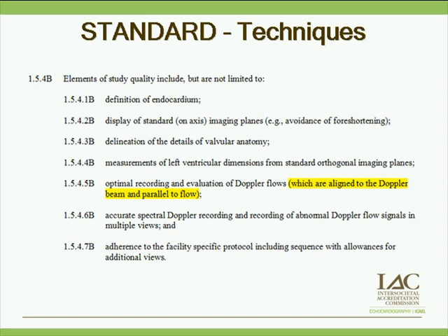Elements of the study include, but are not limited to, definition of endocardium, display of standard on-axis imaging planes, avoiding foreshortening, delineation of the details of the valvular anatomy, measurements of the left ventricular dimensions from standard orthogonal imaging planes, and optimal recording and evaluation of Doppler flows, which are aligned to the Doppler beam and parallel to flow.